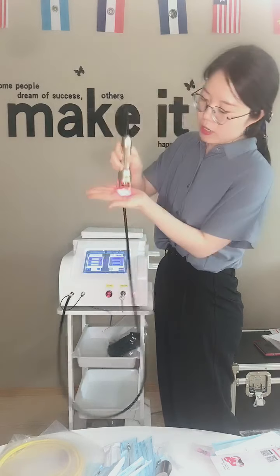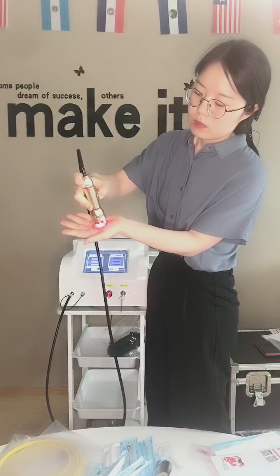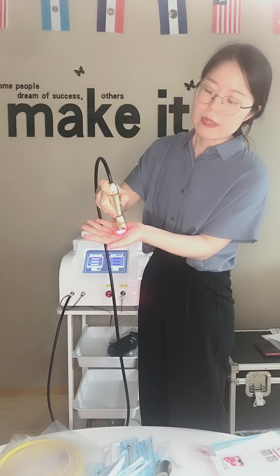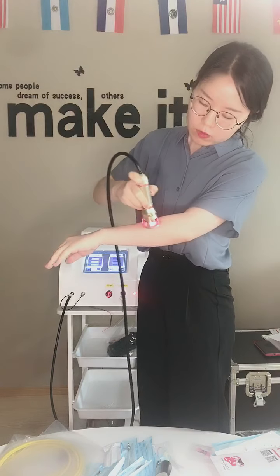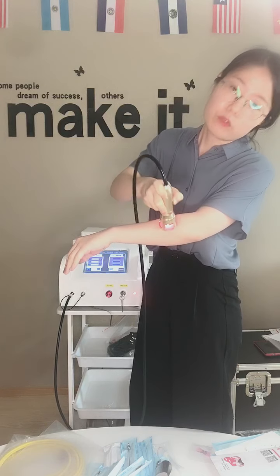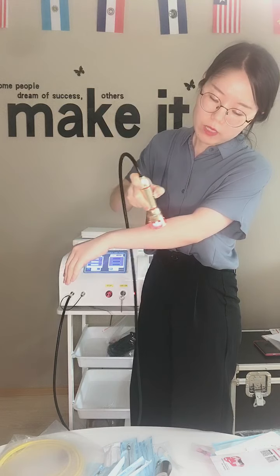Press standby here, and you can see the red light here, and you can just press. You see, I can feel the warm within 3 seconds because I'm a little sensitive to the energy. And when you're doing the treatment, you need to move all the time. Because if you don't move all the time, I will feel very warm. So I need to move it all the time.